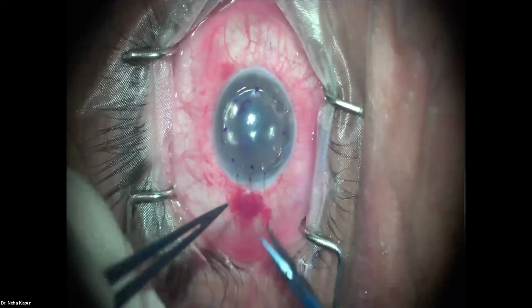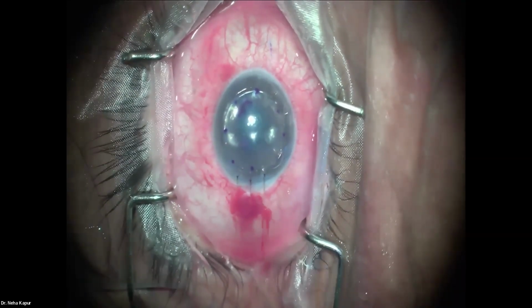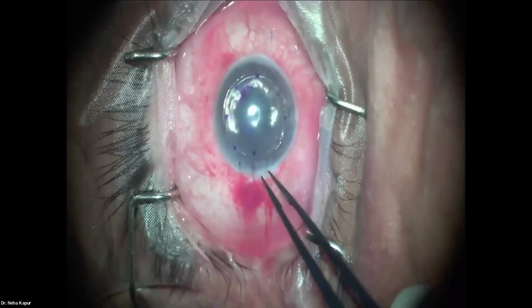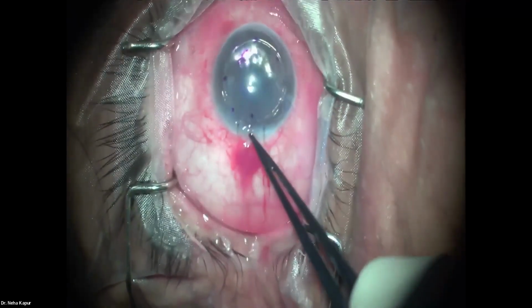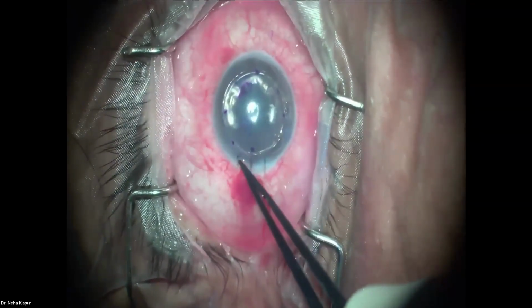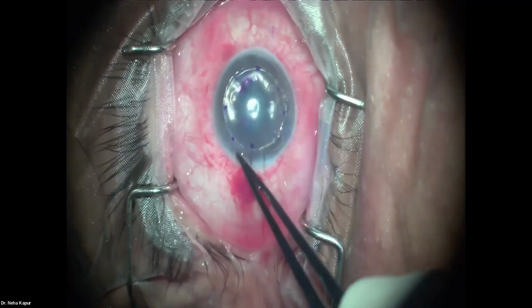One attendee is asking, is this under general anesthesia? No, the patient is under local anesthesia. This patient is not under general anesthesia. It's a short procedure, much safer than a penetrating keratoplasty, and so we don't feel the need of putting the patient through general anesthesia for this procedure.